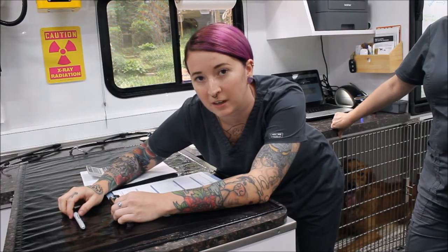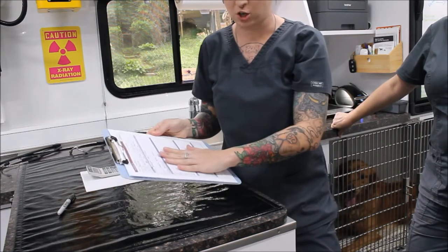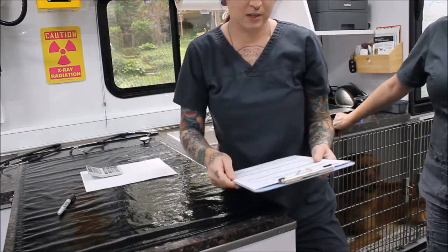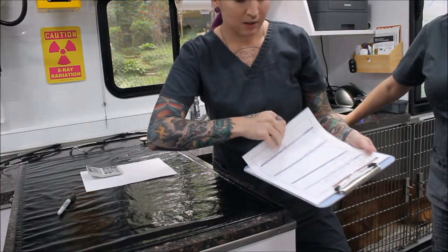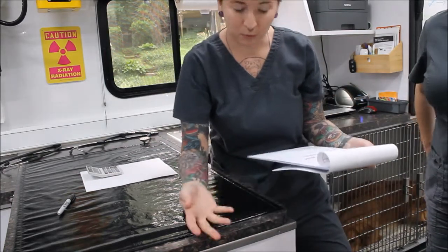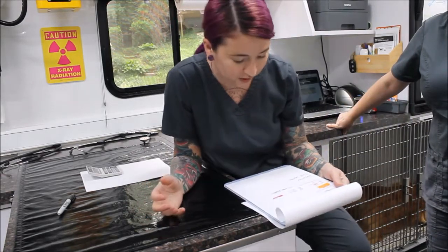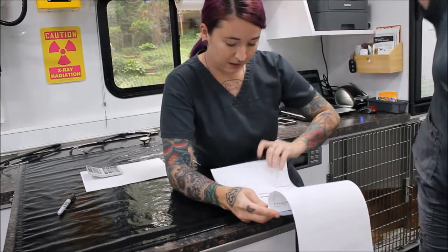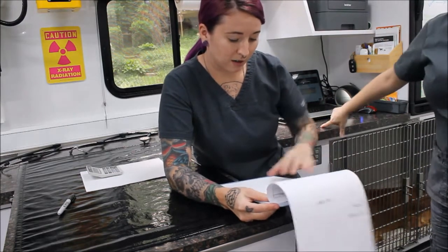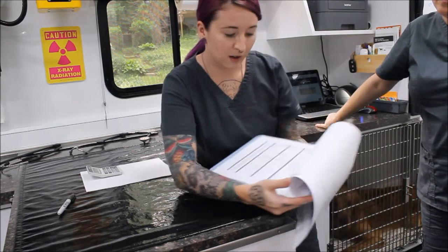In this video I'm going to be going over pre-anesthetic preparation. The first thing I have is my patient's chart and I have confirmed that it is my patient — we've confirmed his last name, the type of dog that he is, confirmed with the owner, the owner's information, and she has signed surgical authorization. Looking back on his record, I'm looking for previous lab work.